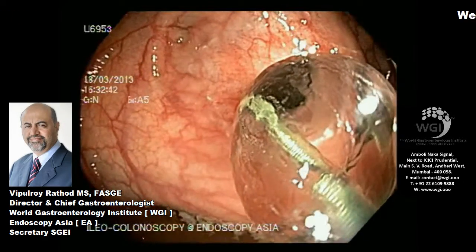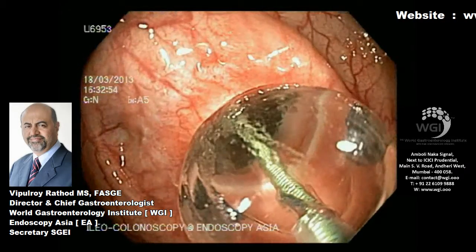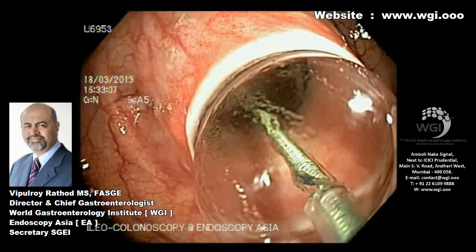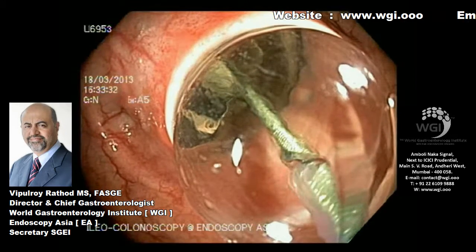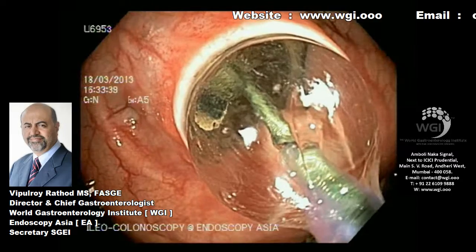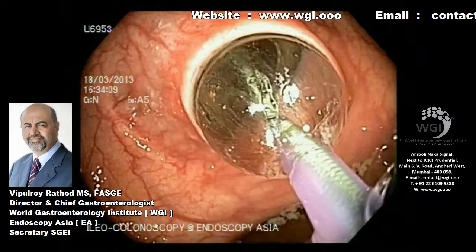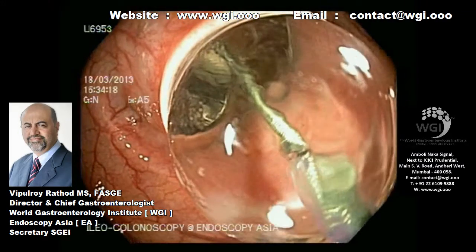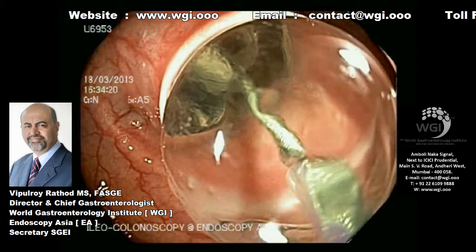As you can see here, the balloon is inflated to 7 atmospheres, and we will hold this controlled expansion of the balloon for another 1 minute until we achieve good dilatation of the stricture.